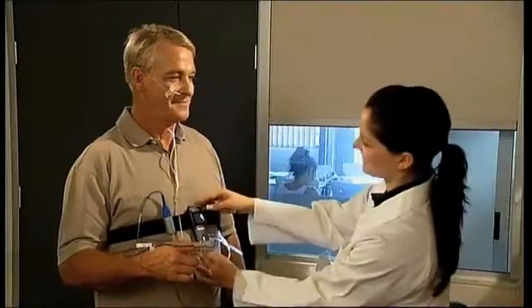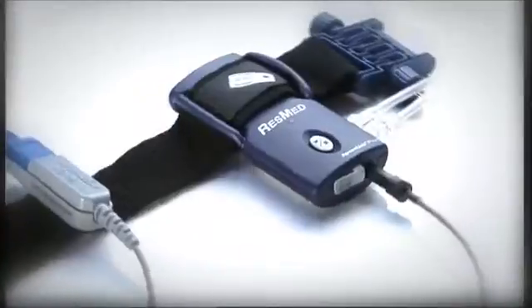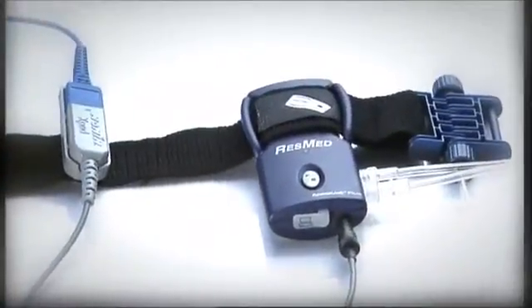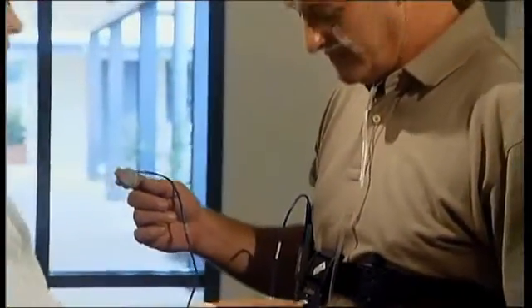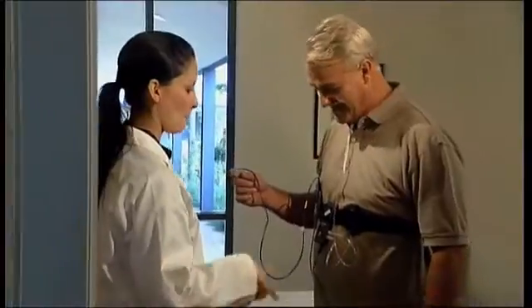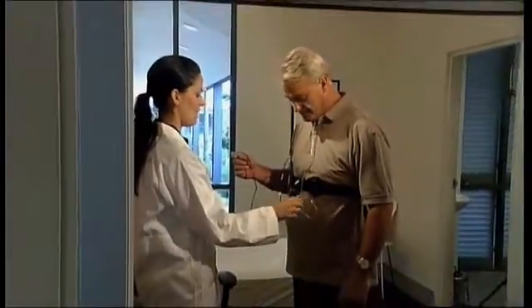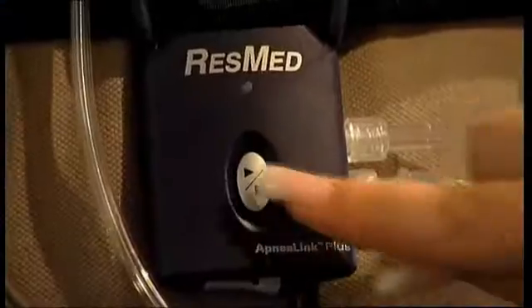Attach the pulse oximetry assembly to the belt alongside the ApneaLink Plus recorder. The system is now fully assembled and ready to start recording. Make sure you give your patients as much information as you can on the ApneaLink Plus — the more they understand, the more likely they are to fully comply and enjoy a successful outcome.